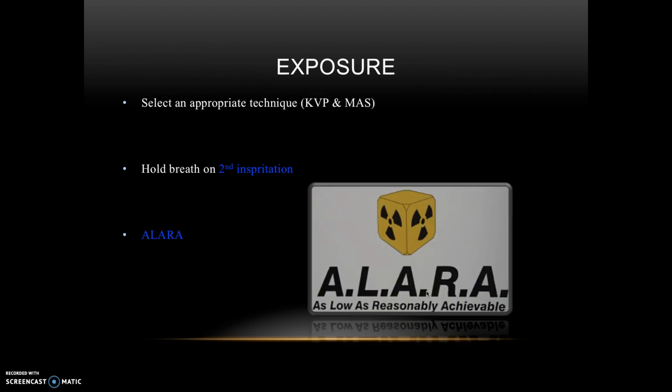We're about to make the exposure. We go back to our control booth. We're going to select an appropriate technique. I won't go into techniques because it can vary a little bit with the type of machine you're using, the company, if you're using digital. So that won't be covered here.